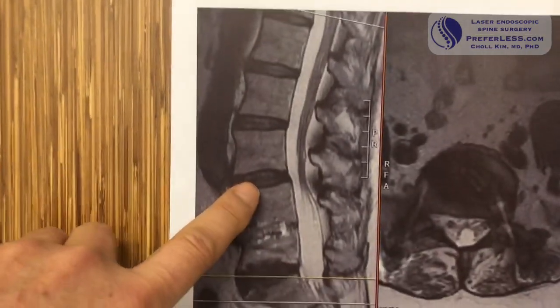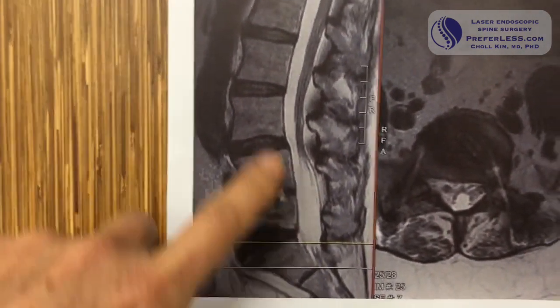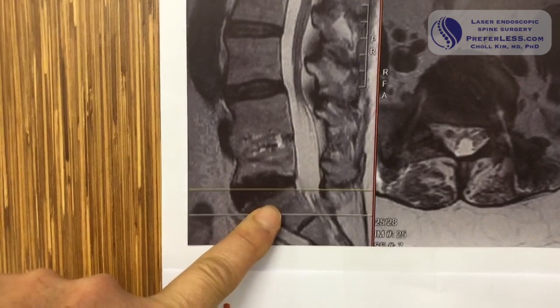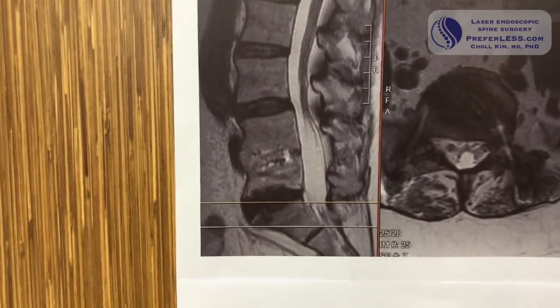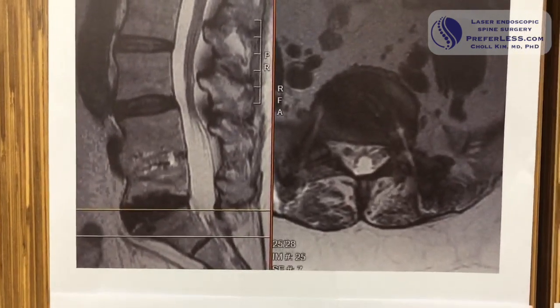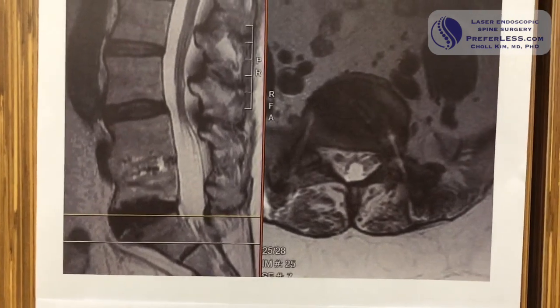And we'll also treat the adjacent level at L3-4 using a lateral technique, so I can put in a very large implant, and we'll do an indirect decompression. So stage 1 lateral, stage 2 L5-S1 pseudarthrosis repair via bilateral MIS-TLIF approach, and L3 to S1 or pelvis instrumented reconstruction. This will take me most of the day, and hopefully she'll still be ready to go home tomorrow. She's a challenging patient, but we're all rooting for her and hoping she can get back to her life as soon as possible.